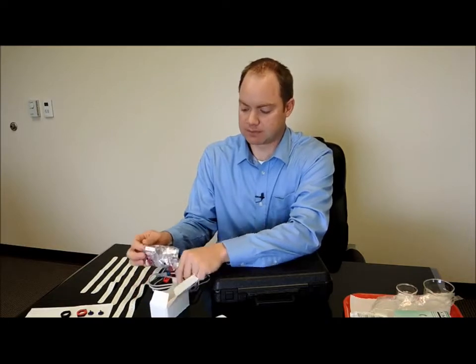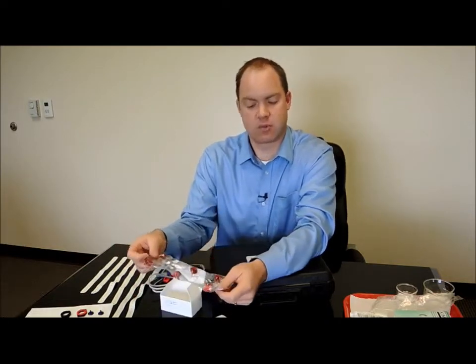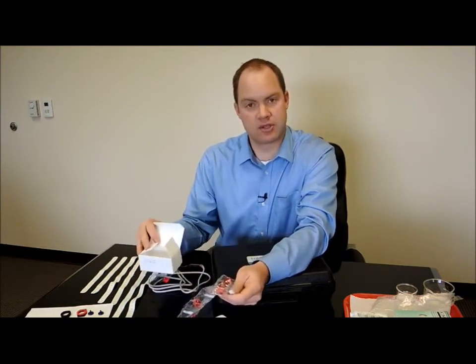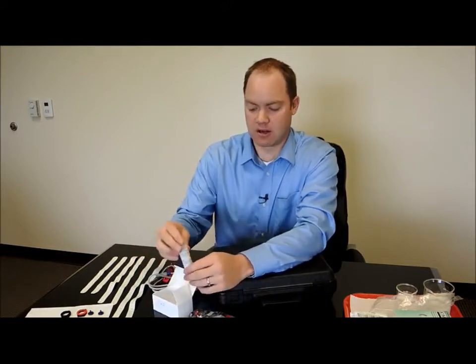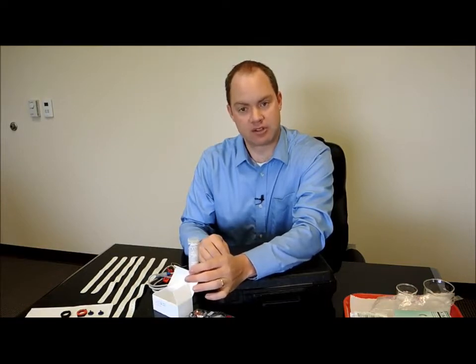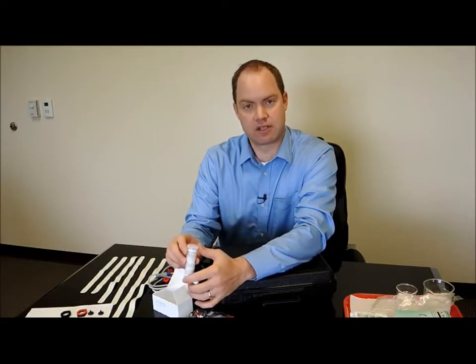Also in the kit are 6 sensor cells. These are one-time use only, and they're disposable. So one kit can do 6 tests. Also part of the kit is a vial of pilogel used for the Nanoduct. Again, we'll use 2 pilogel for each patient, so these are enough for 6 tests.